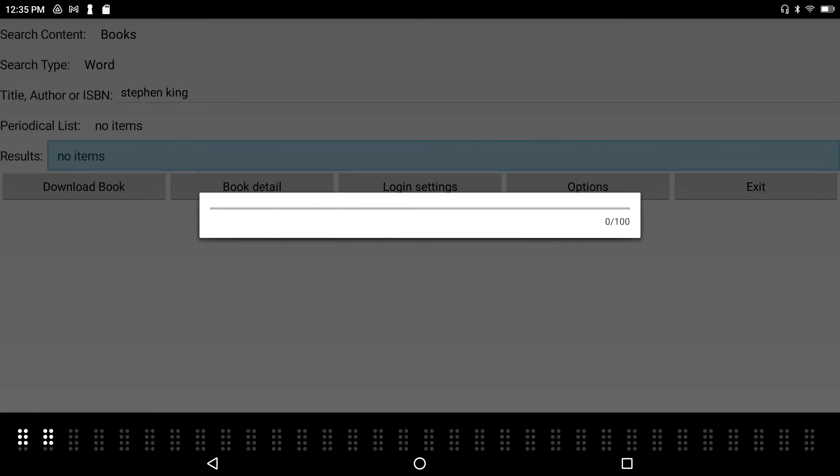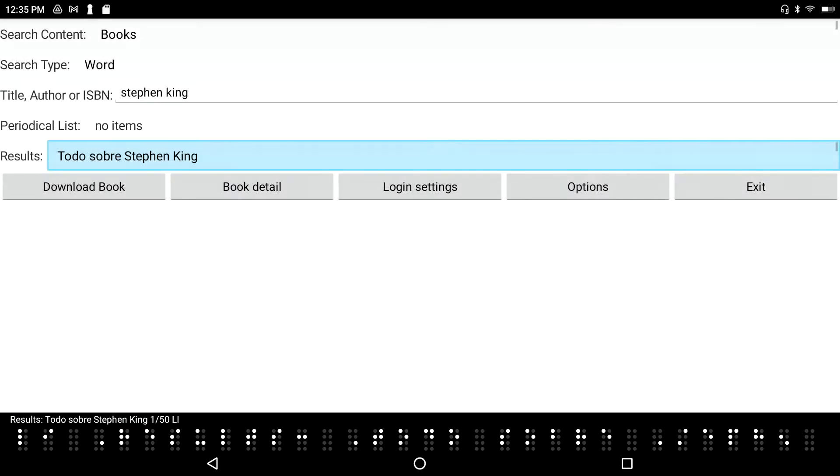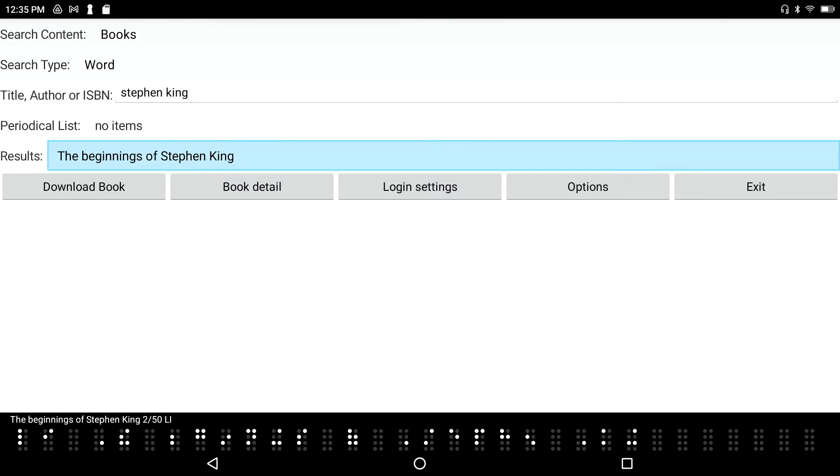Again, the dancing Braille progress cells going from left to right. Results: I've got 50 options in this list. The top 50 options always come up. I'm going to down arrow through here. The Beginnings of Stephen King. That sounds interesting.